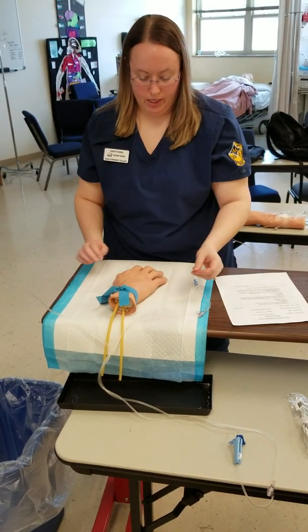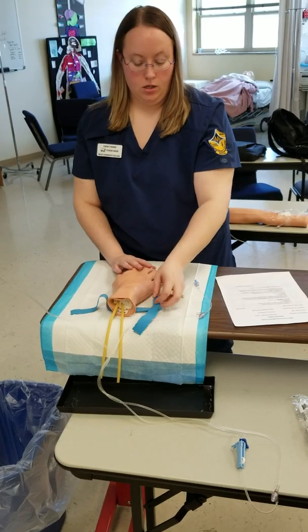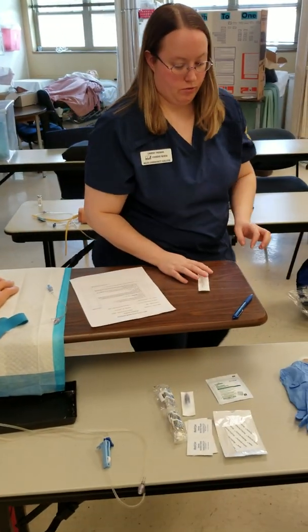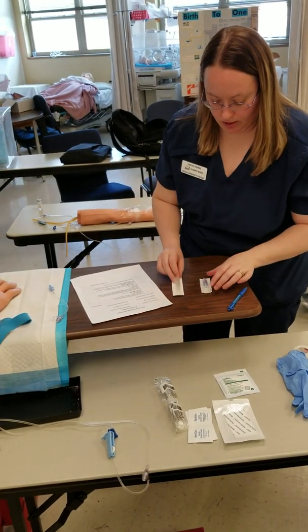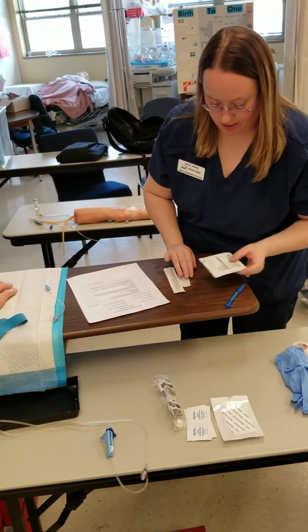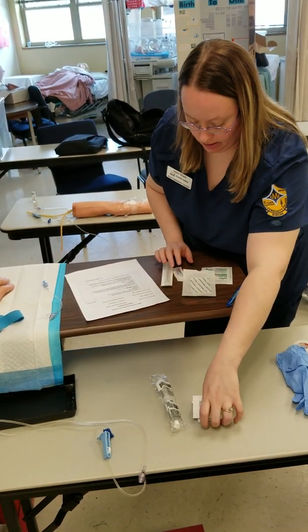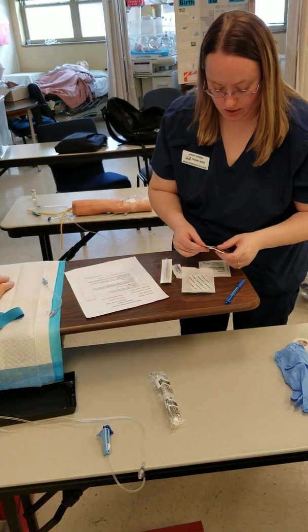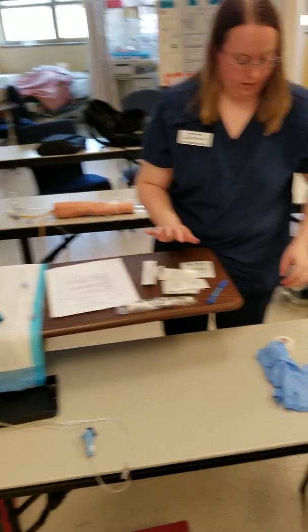Once I've found the right vein, I'm going to remove the tourniquet and I'm going to get my supplies ready. So I would get my needle, my saline lock, my clear dressing, the gauze, my alcohol swabs, and my saline flush.